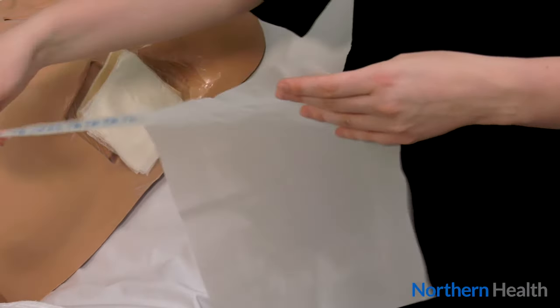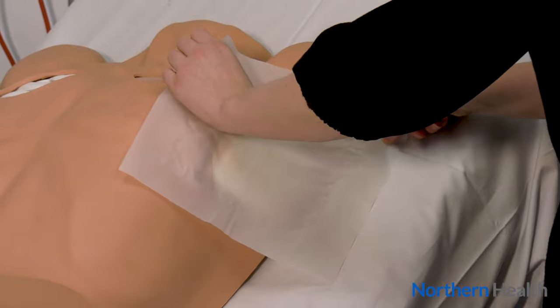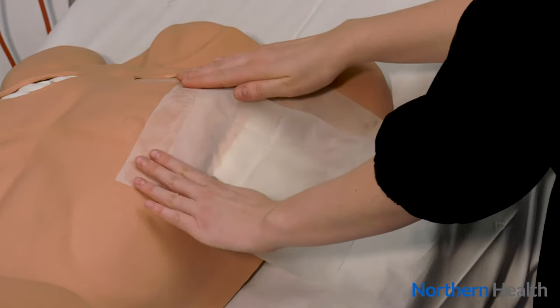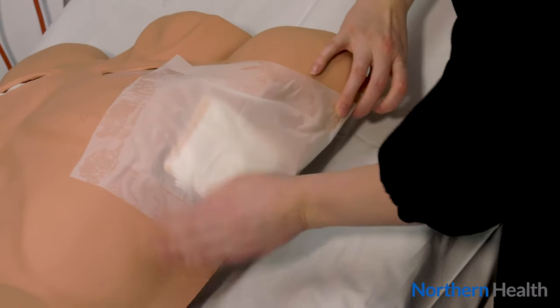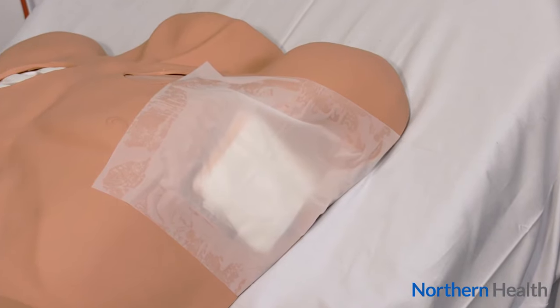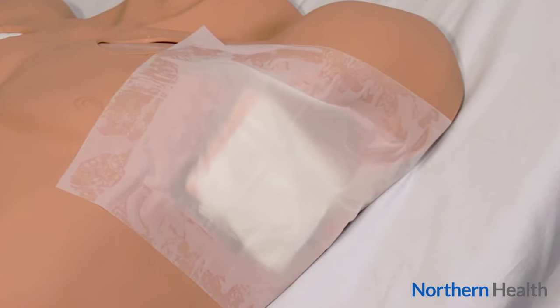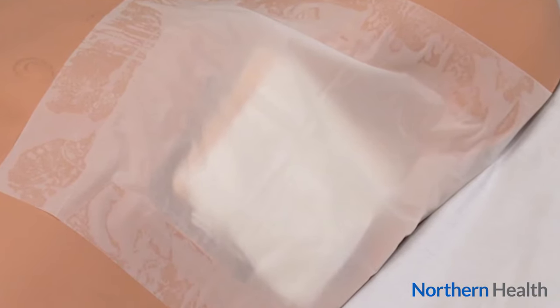It is okay to shower after the IPC or IPEC is inserted. You will be supplied with dressing covers for the shower. It is recommended to keep the dressing as dry as possible until the stitches are removed 10 days after insertion. When showering, try to avoid direct flow of the water over the dressing. If the dressing becomes wet, you can open a kit to change the dressing. It is not recommended to have a bath or swim while the tube is in place. Once the wound heals, after 4 to 8 weeks, you can shower without a dressing.